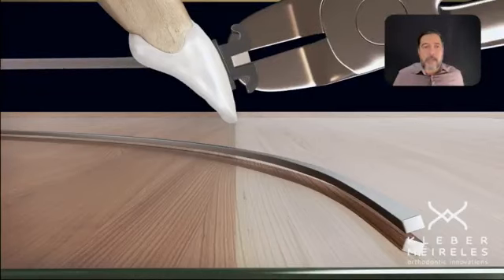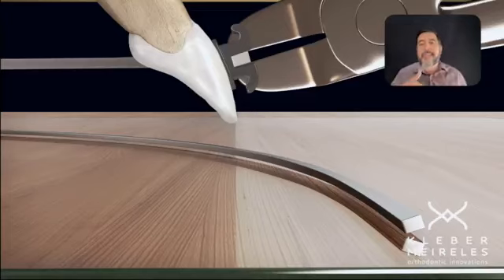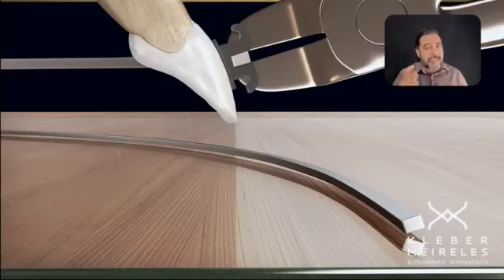So when I insert the wire inside the slot, I will keep the position, because the first rectangular wire is just meant to align teeth, to refine the alignment. And after the first wire, I can change this, giving more or less crown torque, so I can compensate for the right position of those teeth. And then, if I'm doing the retraction, I will apply the same concept that I applied in the class 2 case. I will have the resistant torque, but I don't like to do this in a class 3.